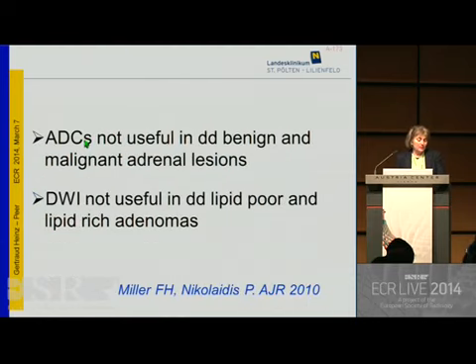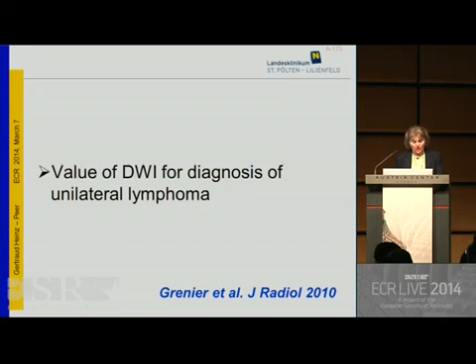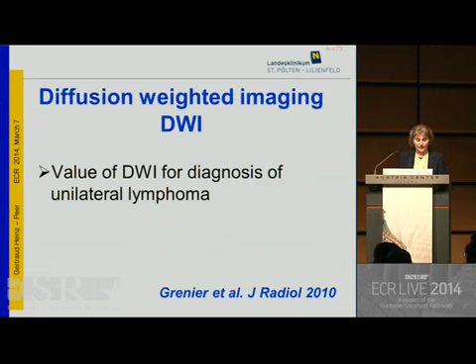So in summary, it has been shown that the ADCs are not useful in the differentiation between benign and malignant adrenal lesions, and that diffusion-weighted imaging is not helpful in differentiation between lipid-poor and lipid-rich adenomas. However, Nicolas Grenier has shown some years ago that there may be a value of DWI for the diagnosis of unilateral lymphoma.